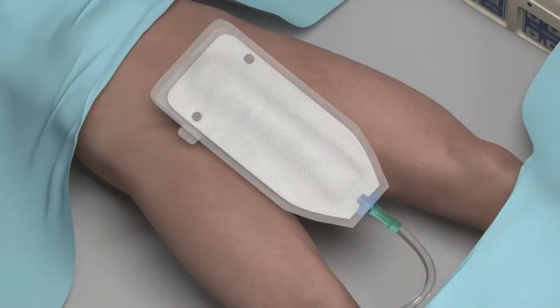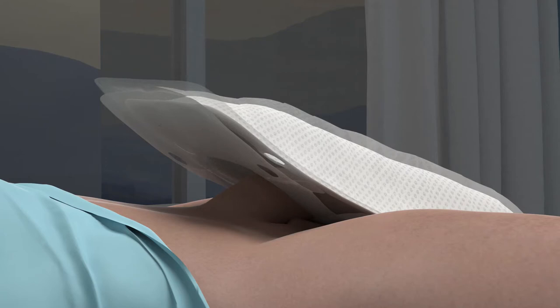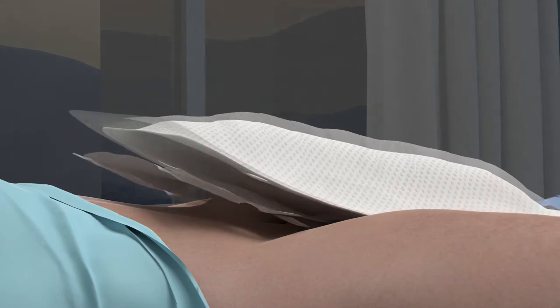To place the PureWick male, orient the device aligning the drainage fitting towards the feet of the patient. Slide the opening of the device over the penis until close to the pelvic skin and center the penis within the opening. Remove the adhesive liner and press the device against the pelvic skin to adhere.